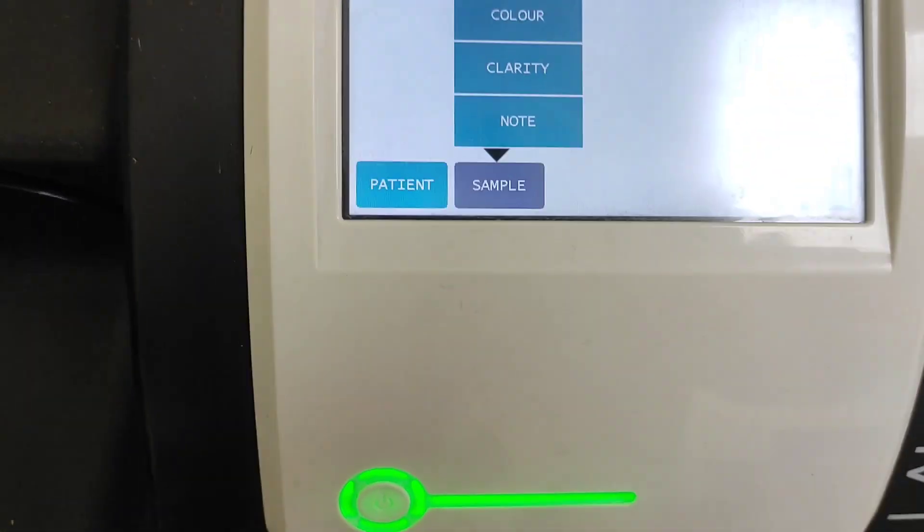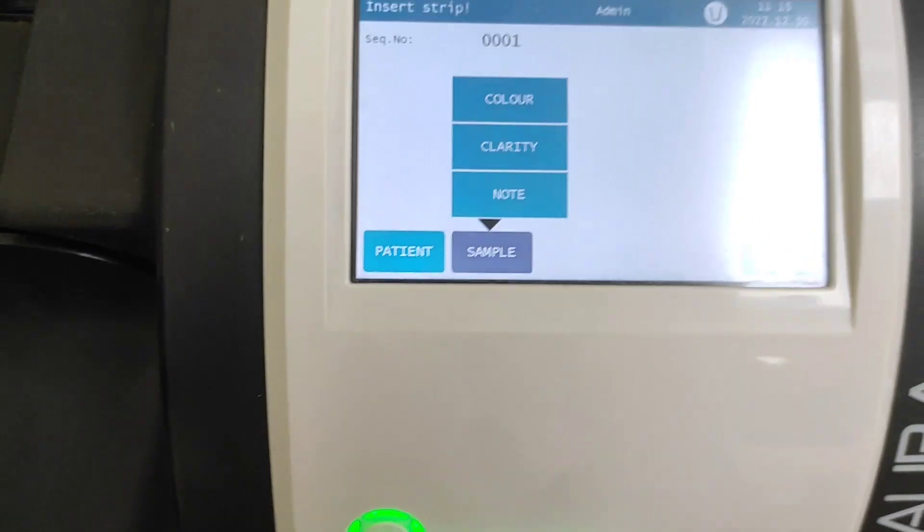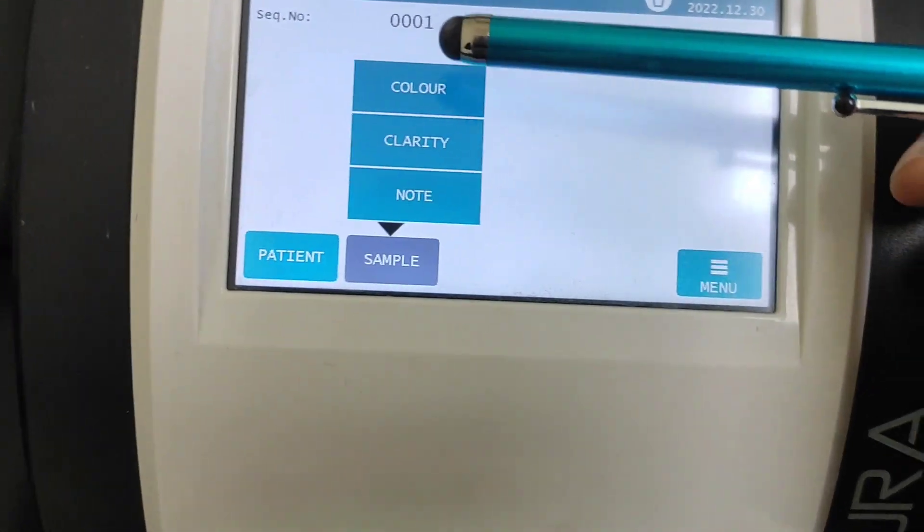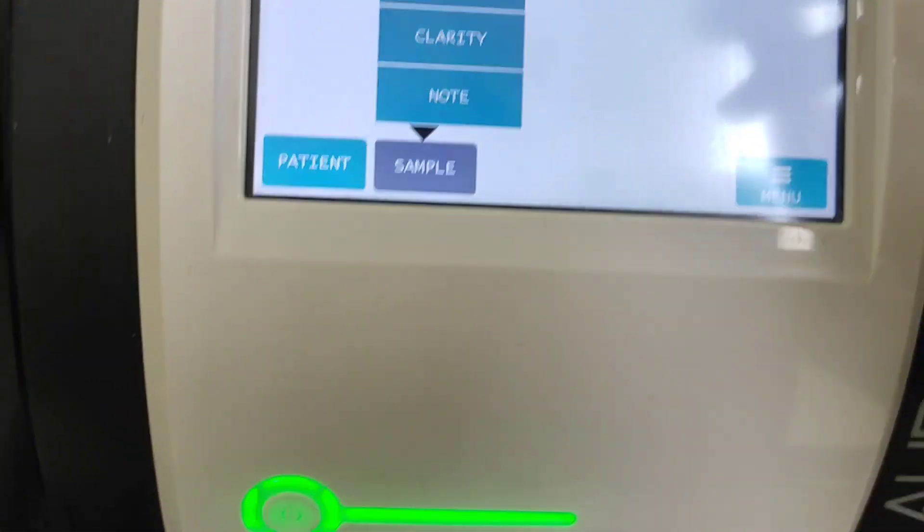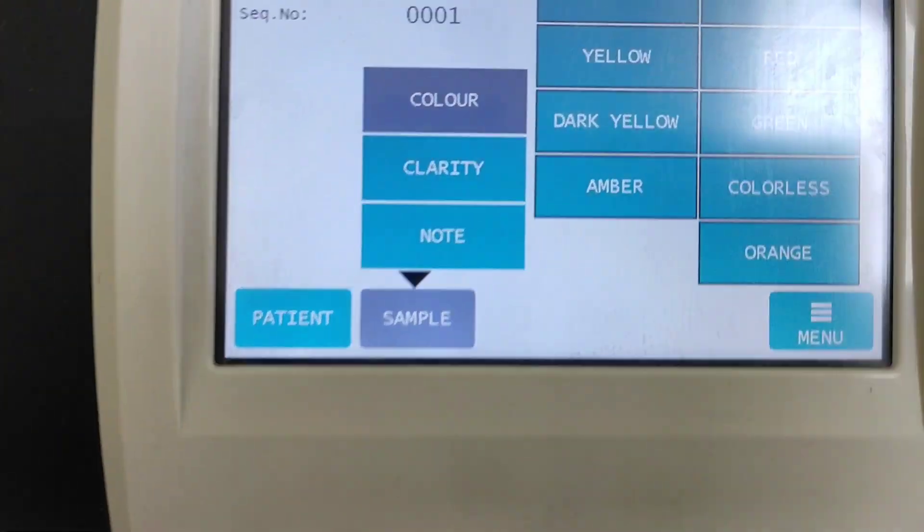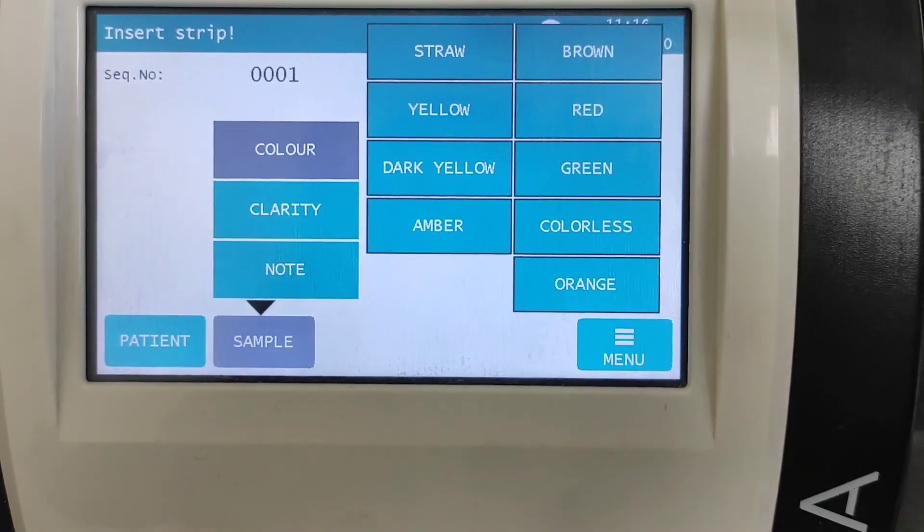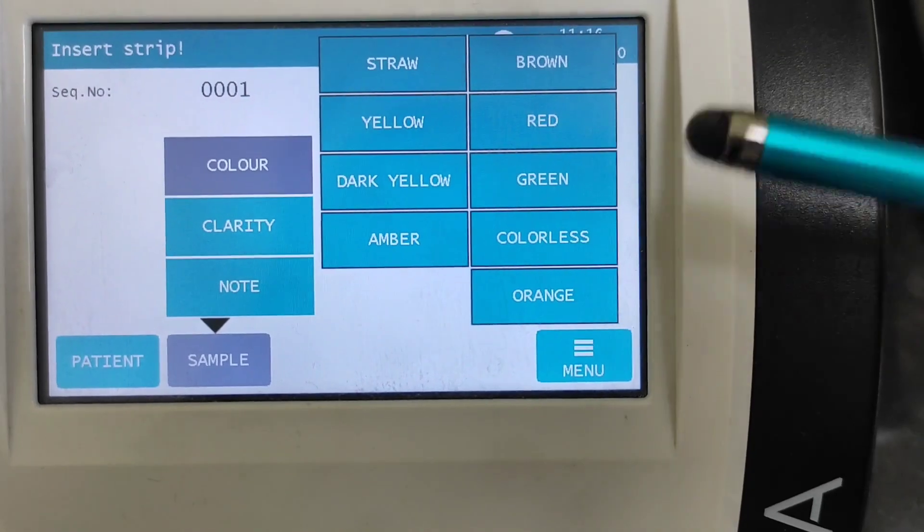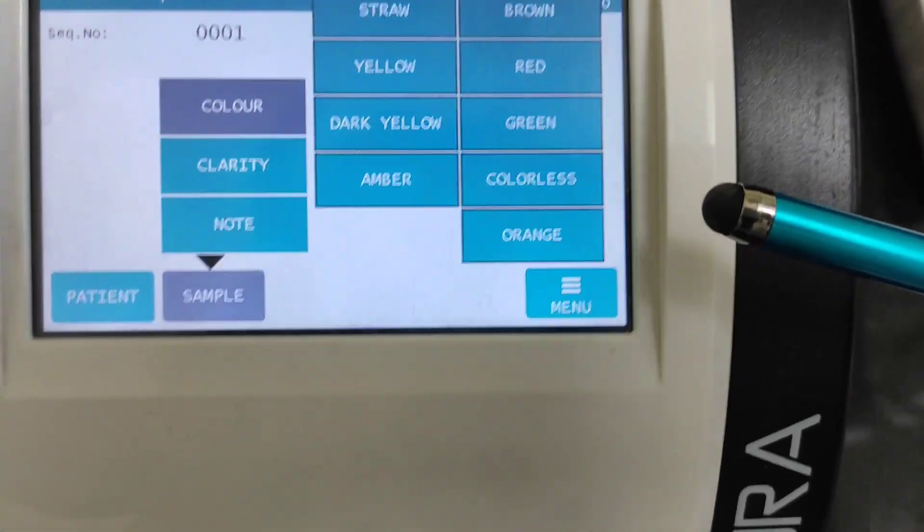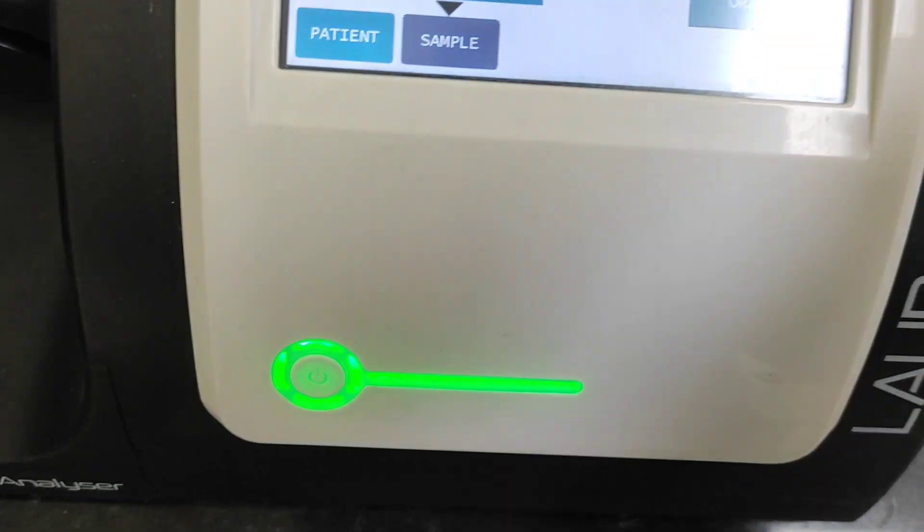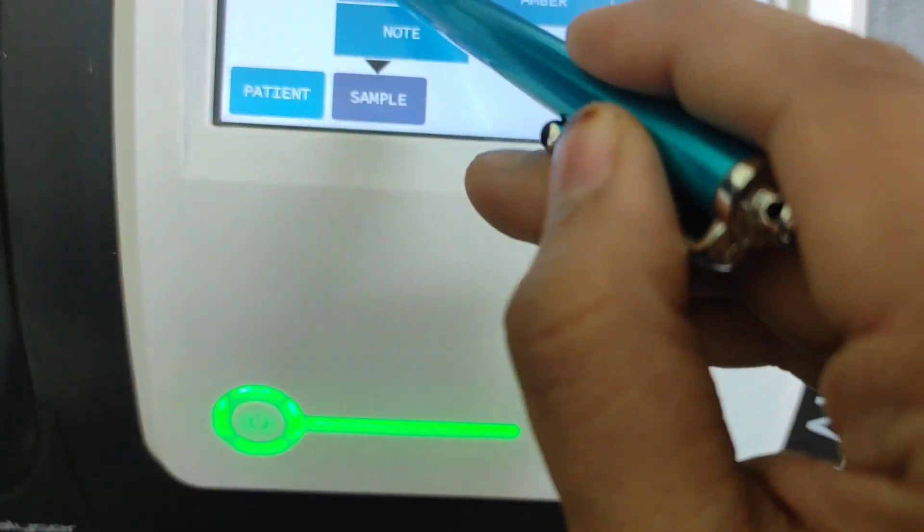Now let's just talk about these samples. Here for the sample, for example urine sample, the color, it will just say colors, you got a lot of options here: straw, yellow, dark yellow, amber, brown, red, green, colorless, or orange. So accordingly you enter.